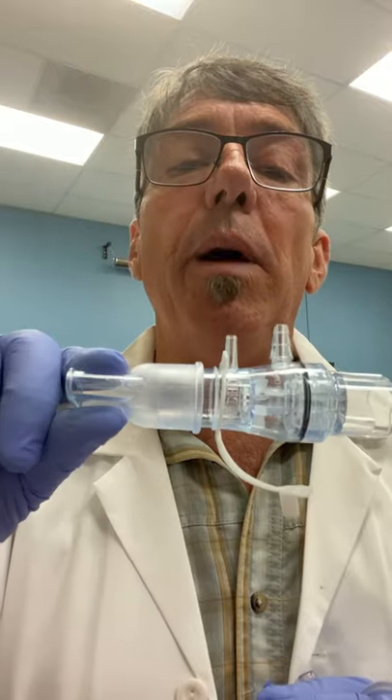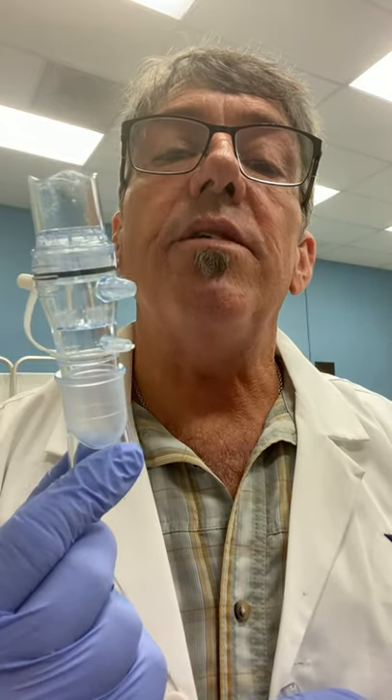Hello everyone, Chris here. Hope everyone's doing well. Today we're going to take a look at the EZ-PAP, another PEP device.